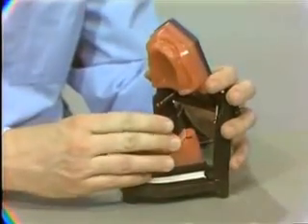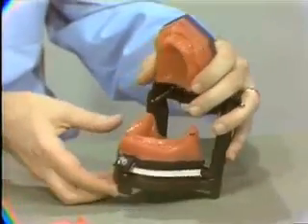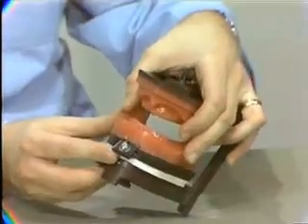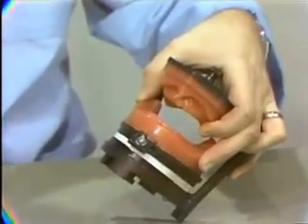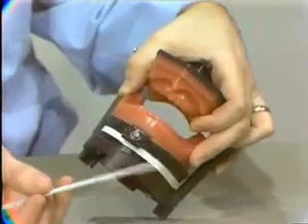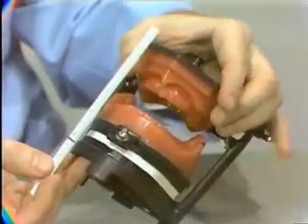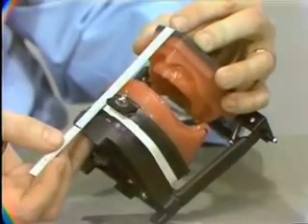Now, in establishing the measurements that we talked about before, in this course, I have to give you measurements because we have no patient to measure. We have no patient to put into physiologic or postural rest position and so forth. So I'm going to give you some measurements so everybody will have the same mounting when we finish the establishment of vertical and centric.